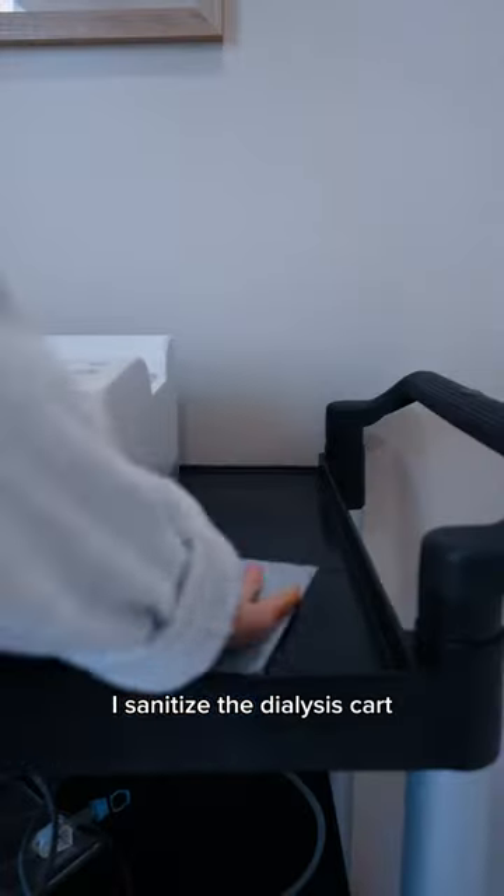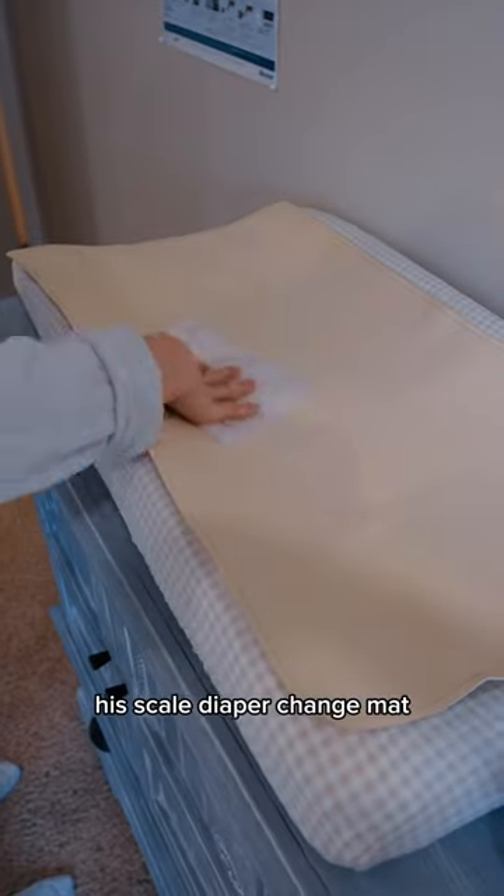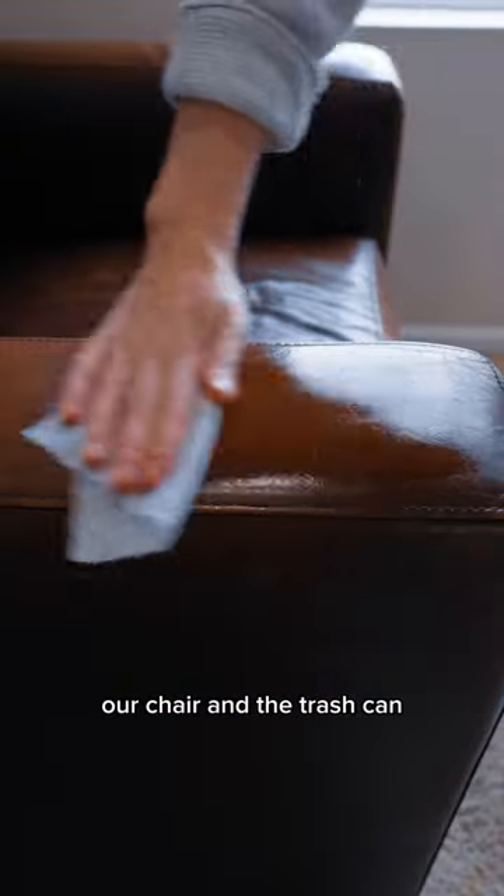Now it's time to sanitize the room. I sanitize the dialysis cart, machine, and his bed frame, his scale, diaper change mat, doorknobs, light switches, our chair, and the trash can.